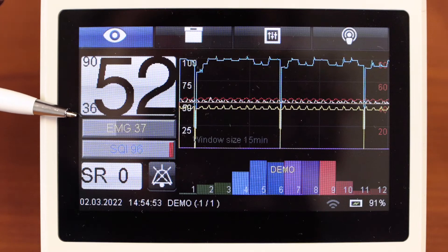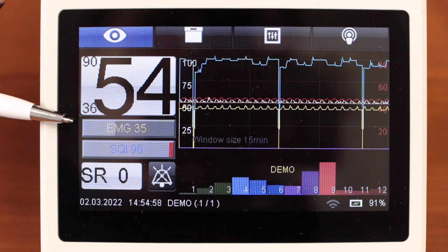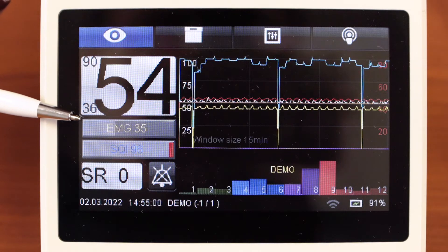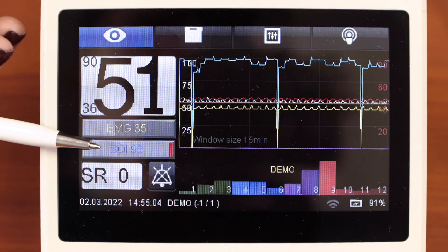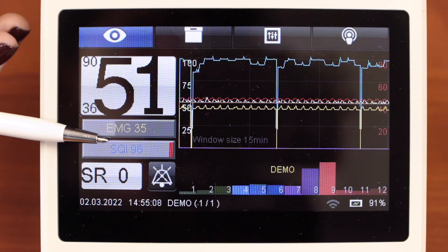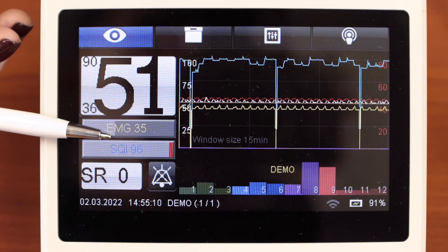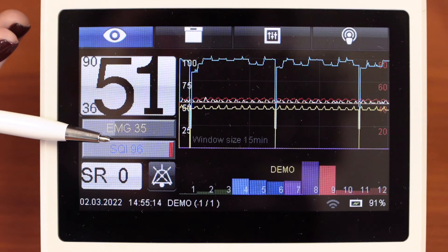EMG component is 35. If it is more than 50, this is estimated as a patient wakes up. Signal quality index is more than 90. It is a very good signal quality. Even with a value of 50, the signal can be assessed as reliable.